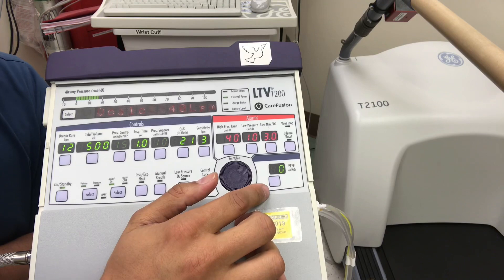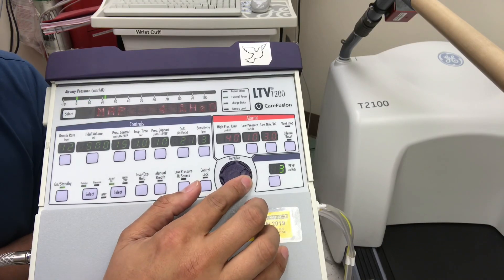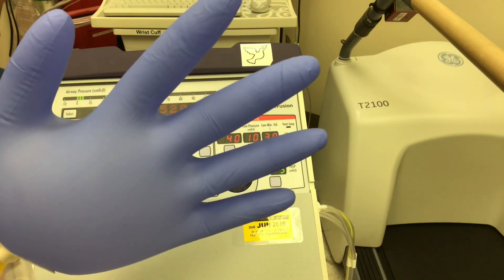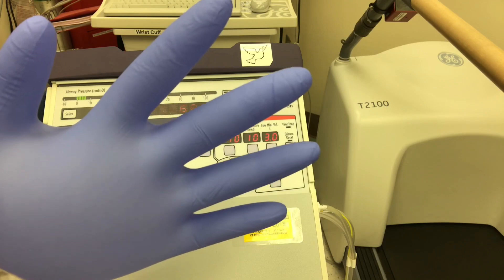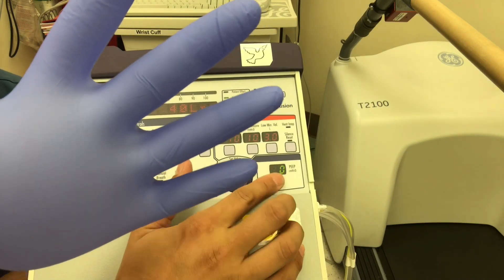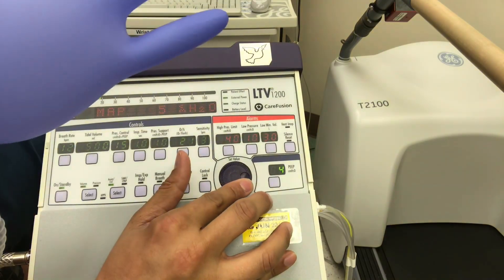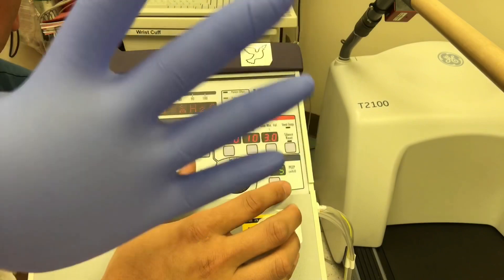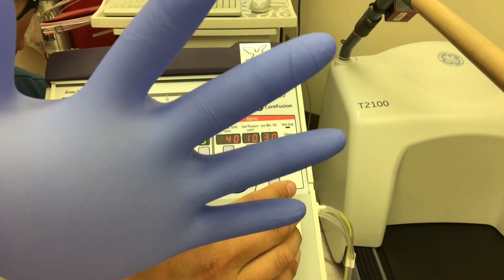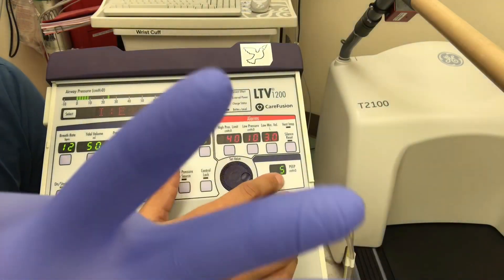Let's dial in some PEEP using the touch-turn interface. Touch the control — everything grays out — then adjust PEEP to 5. Notice what happens to the lung now: it stays open. We give that tidal volume and keep it open. We don't want floppy lungs in our patients. If we turn the PEEP higher, watch the wrinkles come out of those gloves. Let's go back down to 5.